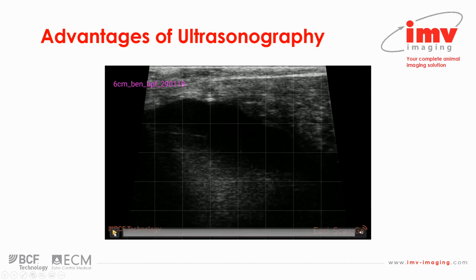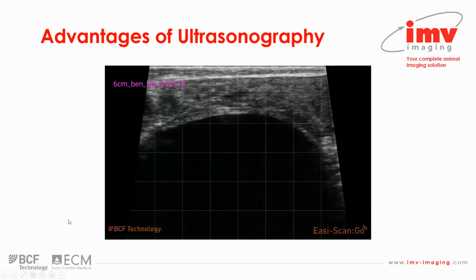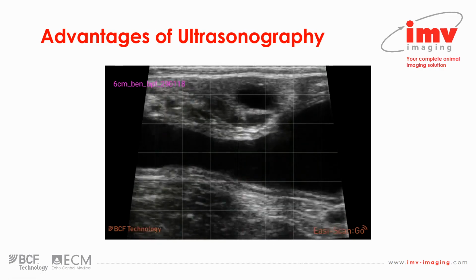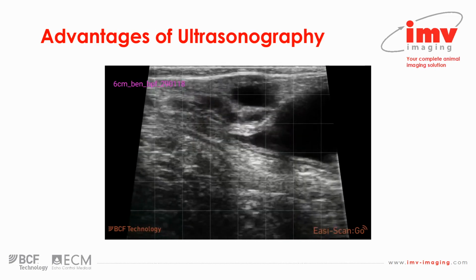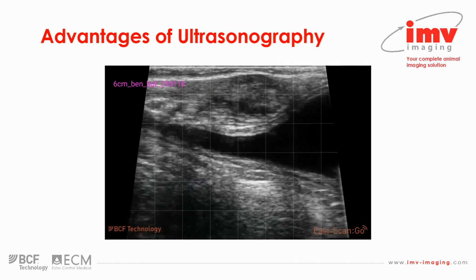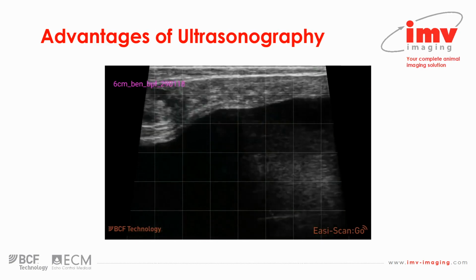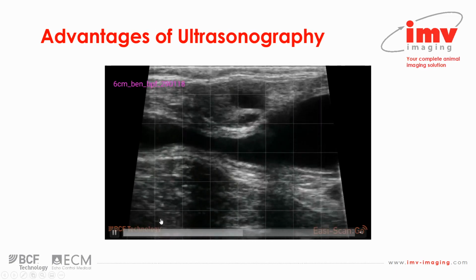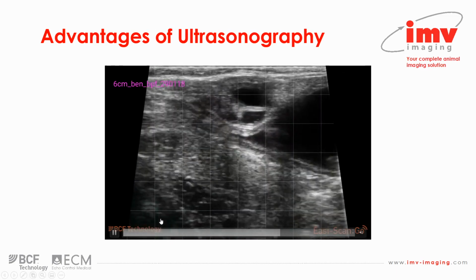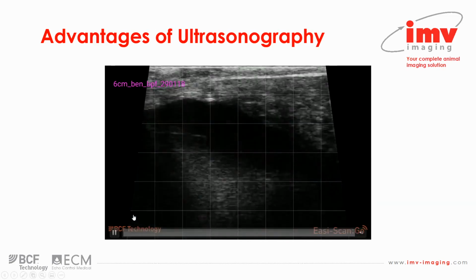So just a video clip here, if I can get this to work. Just assessing an ovarian structure here. So we have one large and several small follicles on an ovary there. And we can then assess that ovary to check that we're happy with what we're looking at, what structures there are, and of course any serial change over time.